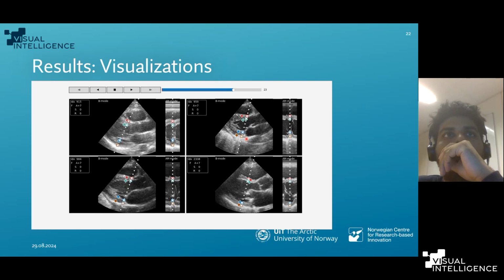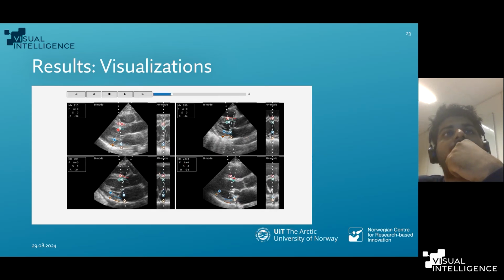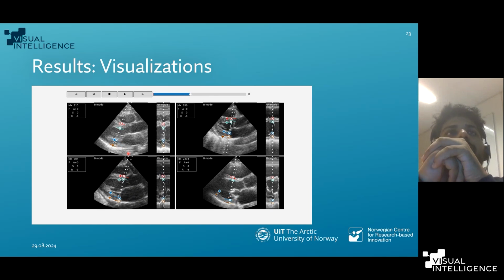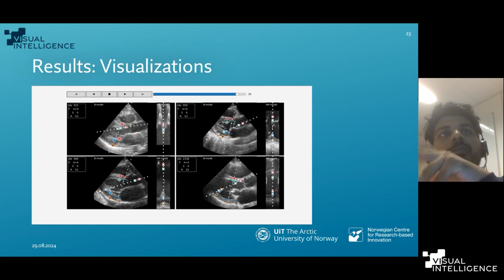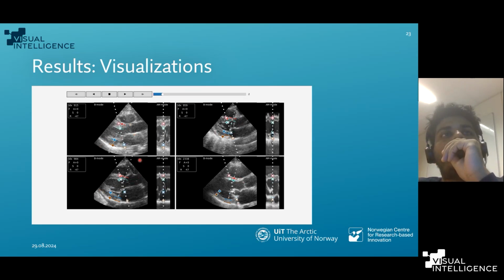So this animation is good, but sometimes I provide a general rotation of the scan line and try to see how the AMM model detects landmarks. We don't have the ground truth to compare it, so I just do qualitative visualization.